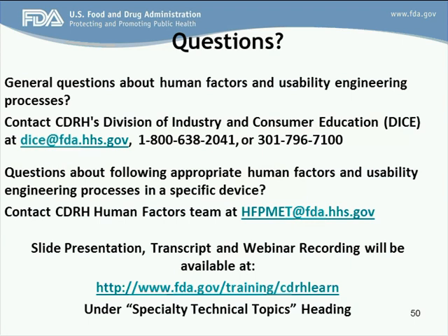Jennifer Tsai, you may ask your question. Hi, can you speak a little more as to what the threshold for serious harm is? What is an example of serious harm, and what is an example of a harm that is not serious? Because when I think through things, almost any medical device can cause patient injury of some sort, or at least it's providing therapy, and if someone can't use it, then the patient's not getting a therapy. So I'm trying to get a better understanding of that, because the process seems very either-or right now. Either the device can cause serious harm and you want a validation study and the data submitted in a report, or the alternative is that nothing needs to be submitted to FDA. You don't need to see or ever hear about any of the human factors work that was done in that case, not even a rationale as to why we aren't submitting anything. So is that a correct understanding?